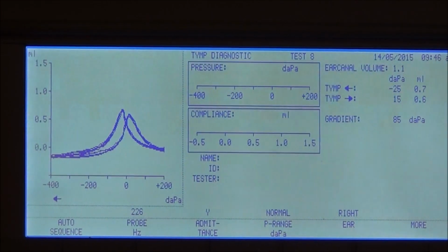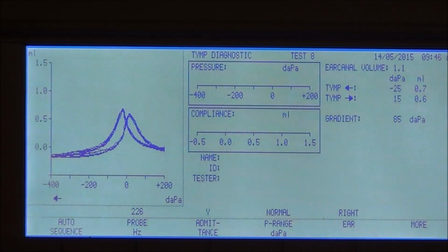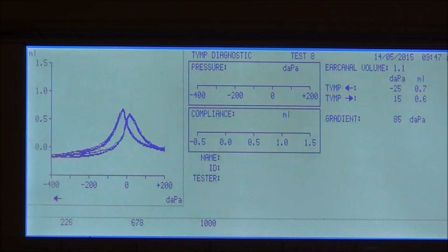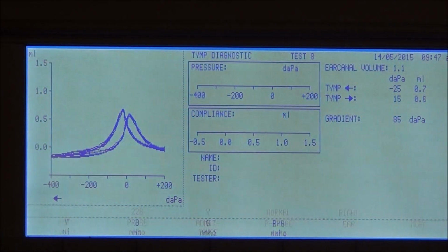Do you understand? It should be stiffness dominating the pathology. Only then will that hold good. Do you get it? In any of the other cases, you have to change the probe tone frequency, right? And you have to measure more than one component. So these are the components of it.